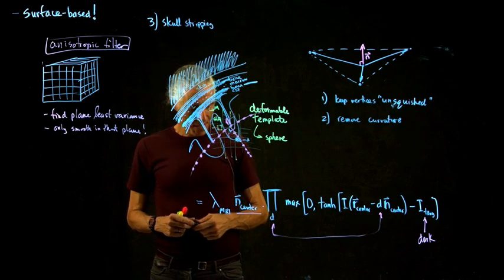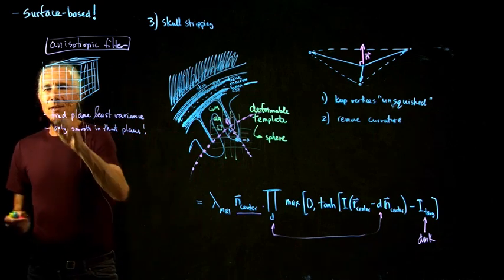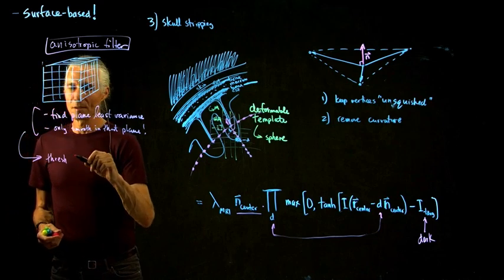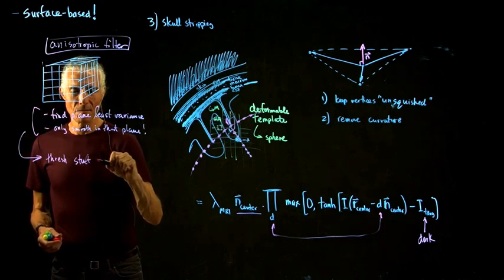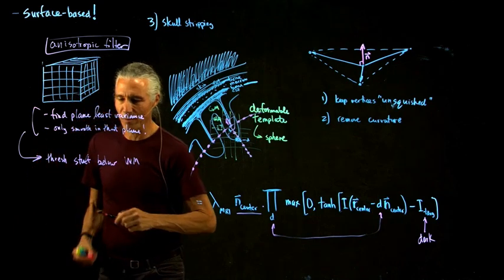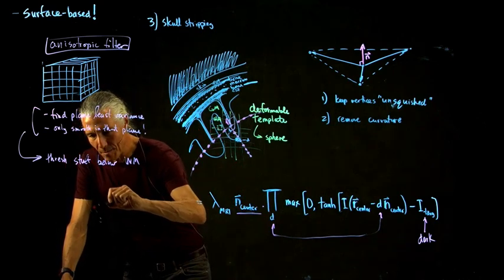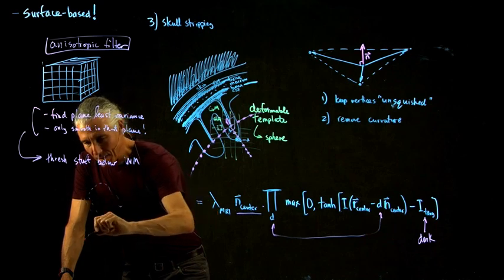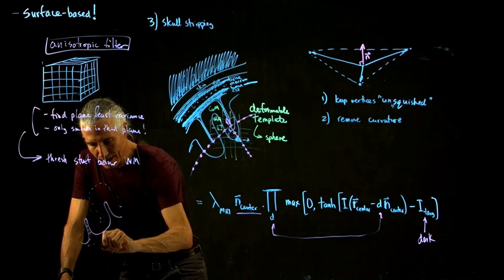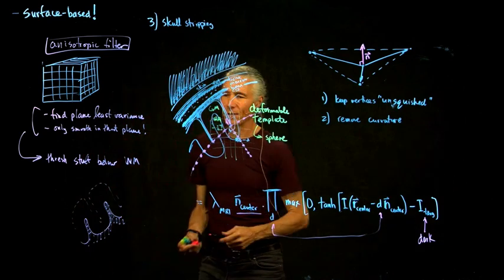Okay, so now we've got something that is pretty much just the white matter. After we've done this, we could just threshold stuff below white matter. So anything that's darker than white matter, we get rid of it. Here was where the cortex used to be, but now we just have this kind of eroded white matter glob. So now our data set just looks like this, just white matter. Okay, we got rid of all the gray matter.